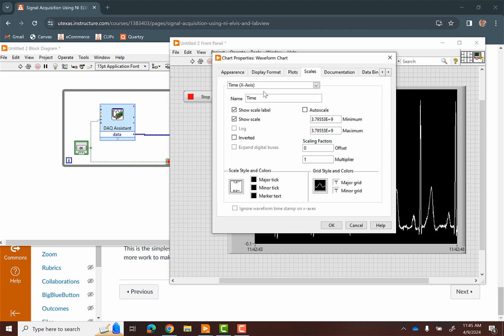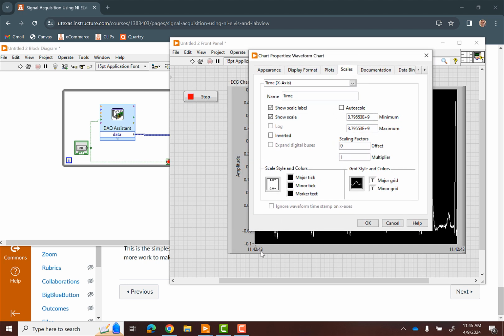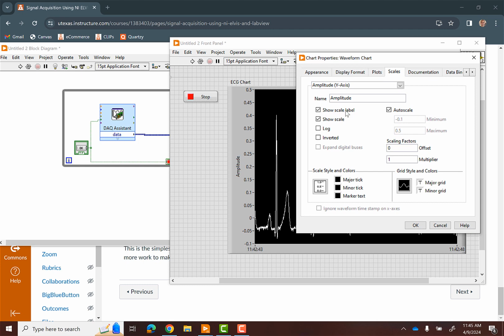And then we can change our scales, right? And so right now the X scale just goes for about 5 seconds. Like these numbers are kind of weird. I will tell you that right now, but those correspond to the time. So we will want to fix that in a second. But the first thing I'm going to show you is the Y, right? So number one, it's auto scaling to whatever the current values are, right? So there's a chance that it shifts up and down. And so that would just kind of change how it looks.